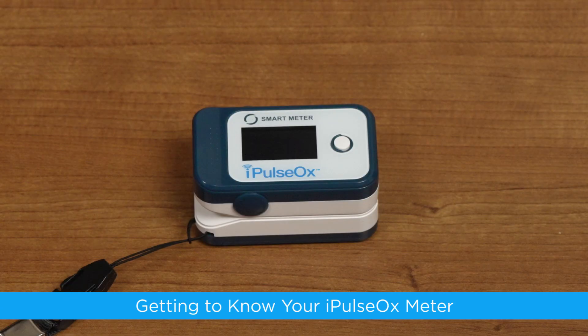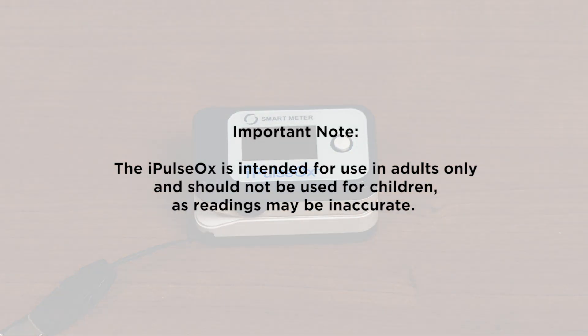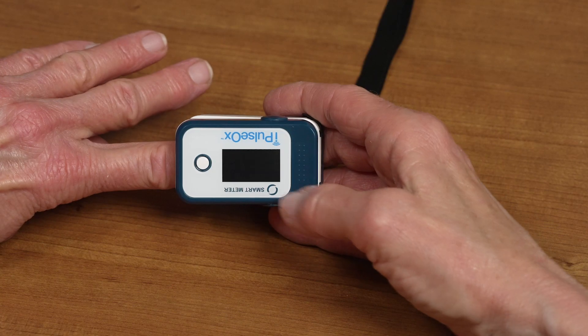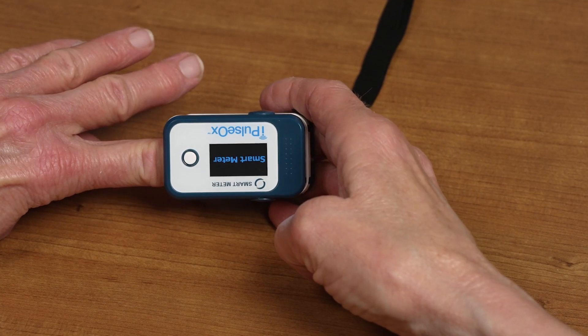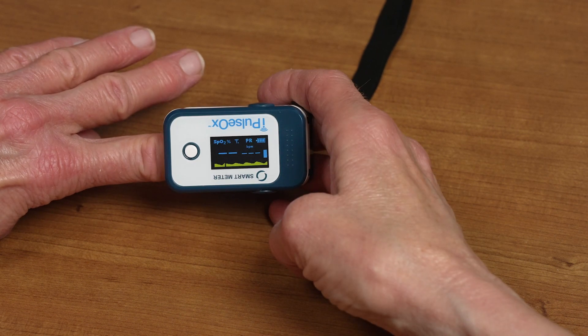Getting to know your I-Pulse Ox Meter. The I-Pulse Ox has a simple one-button operation design, making it easy to use. It's important to note that the I-Pulse Ox is intended for use in adults only and should not be used for children, as readings may be inaccurate. The I-Pulse Ox has an LCD display screen that shows SpO2 percentage, pulse rate, battery life, and cell signal. The I-Pulse Ox can be used on either hand, and the screen can be rotated for easier viewing by simply pressing the button during a reading.